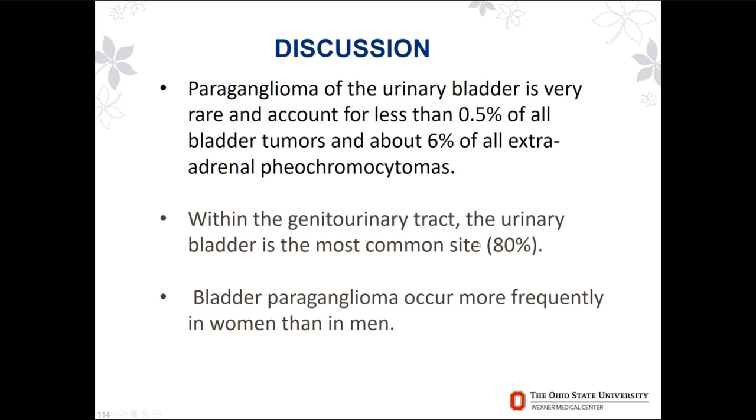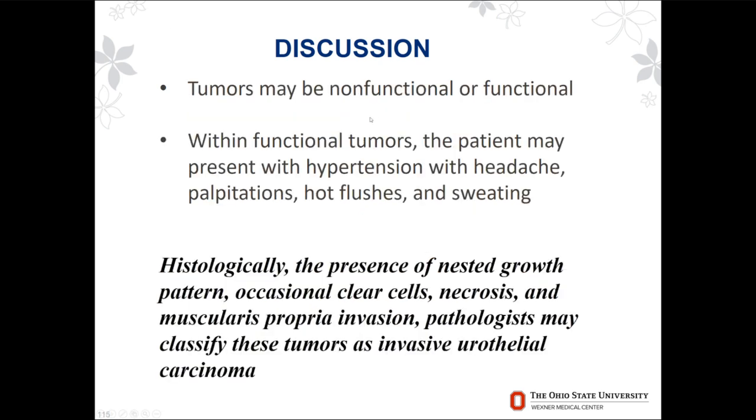And so you're going to see this. And I've seen this very frequently misdiagnosed because of the GATA3 staining. This occurs more frequently in women than in men. So the tumor may be functional. The key thing to remember is this tumor may be non-functional or functional. With functional tumors, the patient may present with hypertension, headache, palpitations, hot flushes, and sweating.